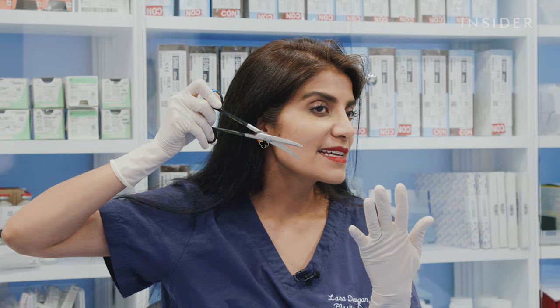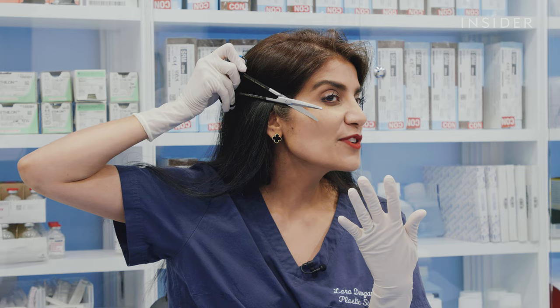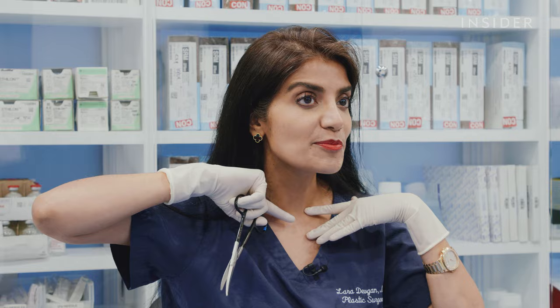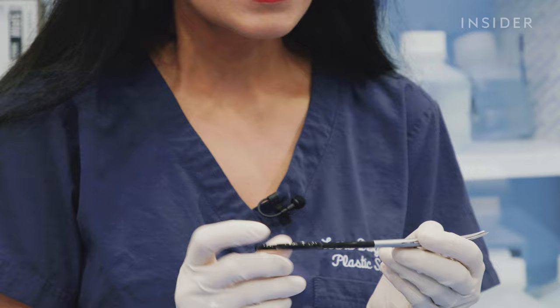And when the Gorney scissors are used appropriately, this pair of scissors can move freely, exactly how I'm holding it, from here all the way down here, through the neck, all the way over here. And you can really literally separate someone's face from the deep structures below it, and separate someone's neck from the deep structures below it. So this small pair of scissors really represents the pinnacle of what is possible with plastic surgery in understanding the key anatomy of the face and how to do good and not harm with it.